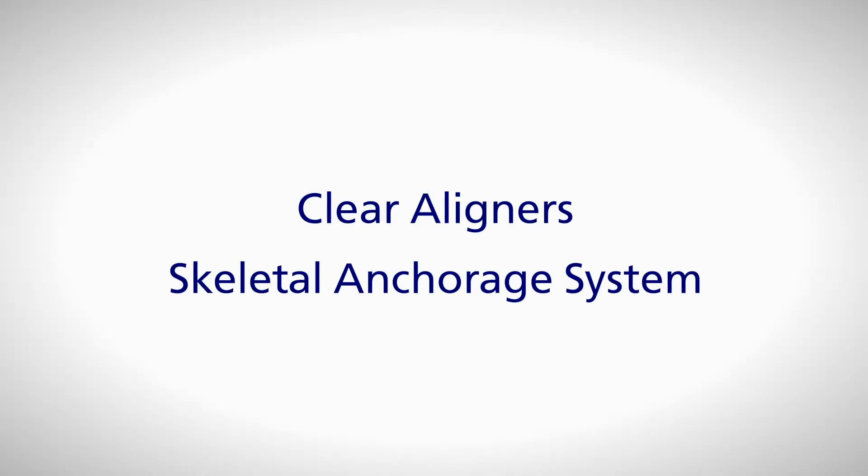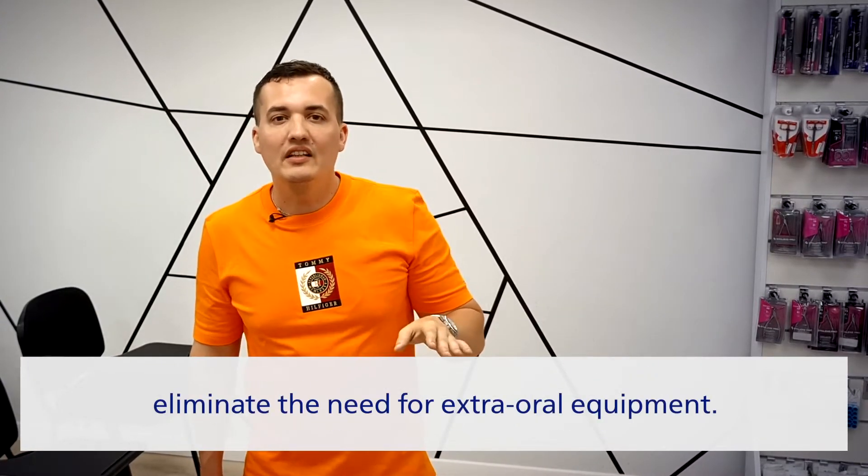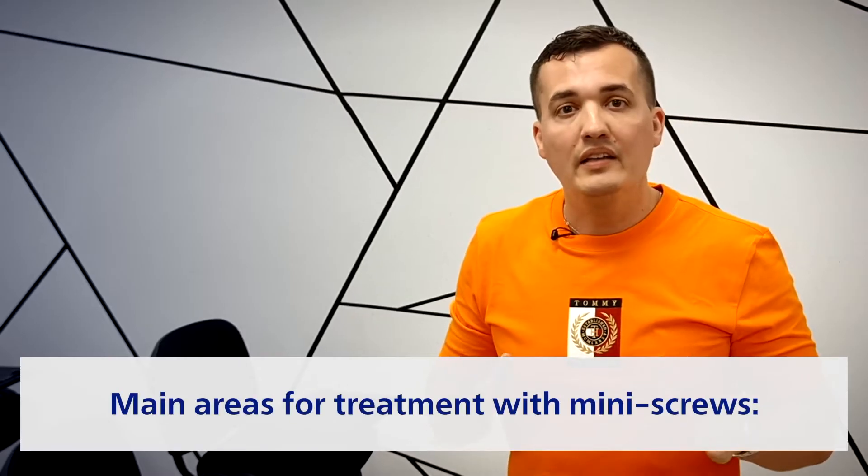Let's not waste time and welcome aboard. The technology of orthodontic treatment has had no revolutionary changes during the past years after two major innovations were made, making the process easier, faster, and more effective than ever. I speak about the clear aligners and skeletal anchorage system.